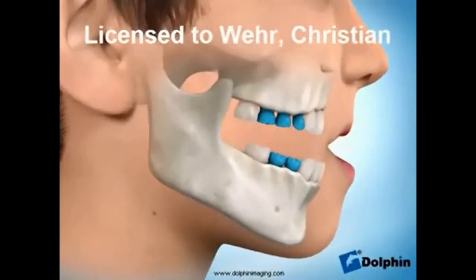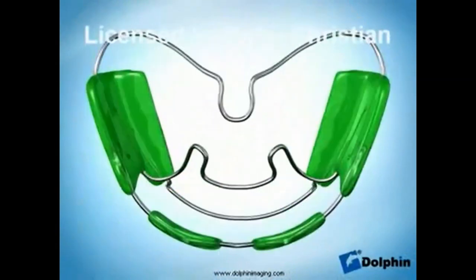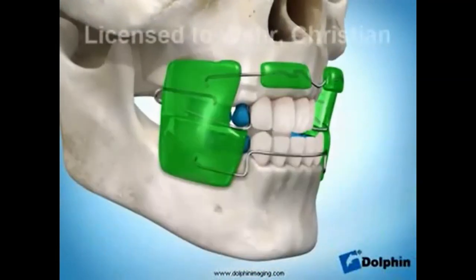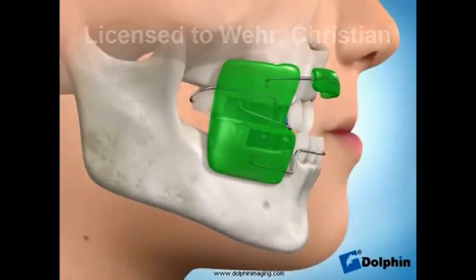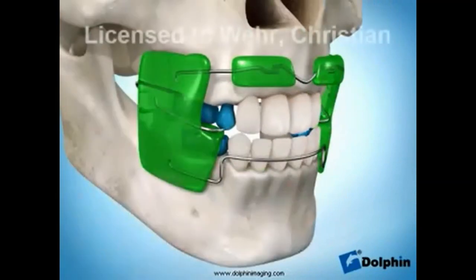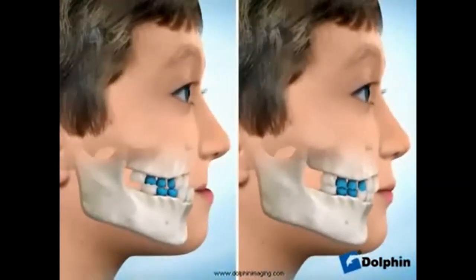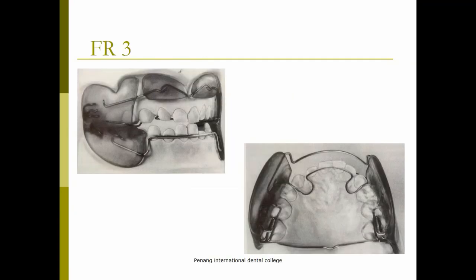So if you look at the structure, there is a minimal change. The patient is class 3 and here I want the patient's maxilla to grow. So in that case, I will have the lip pads in the maxilla, not in the mandible, because I want to keep the restraining effect of the upper lip away from the maxilla and the maxillary dentition, and I want to let the maxilla grow to its fullest possible potential. Instead, the labial bow is transferred to the mandibular anteriors to have a mild restraining effect on the mandible. So that's how, with FR2 and FR3, the moment you look at them, you know the function for which it is given. Your position of lip pads and labial bows are opposite in both of them. So that's your FR3, same components but reverse position.